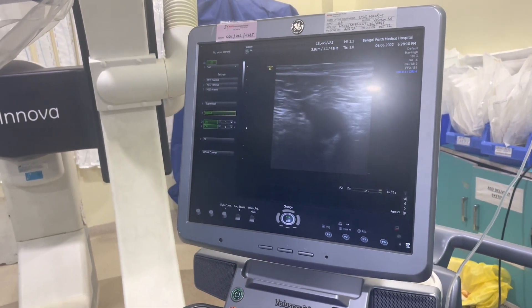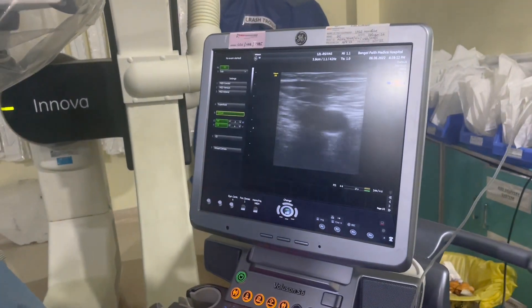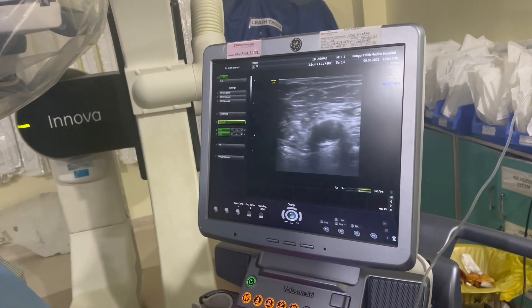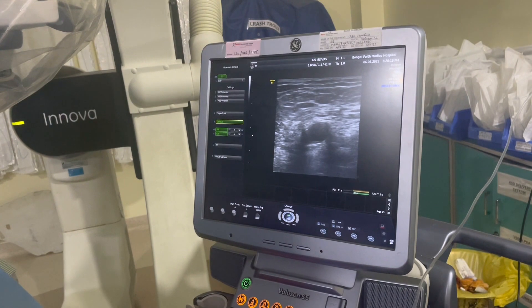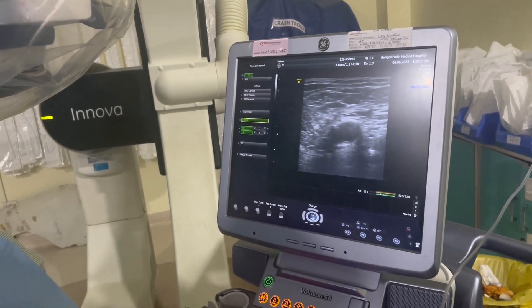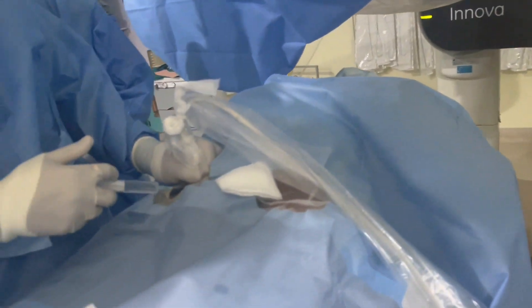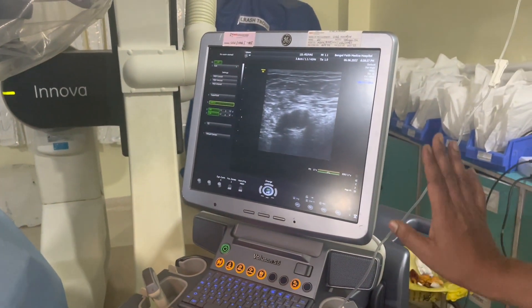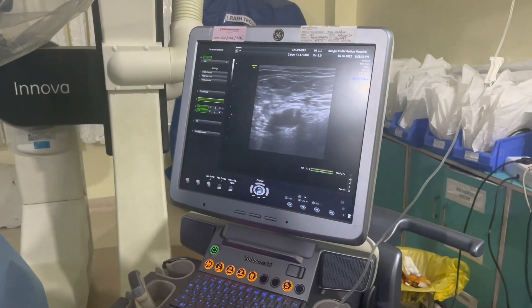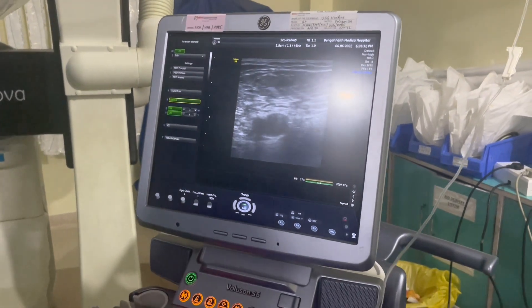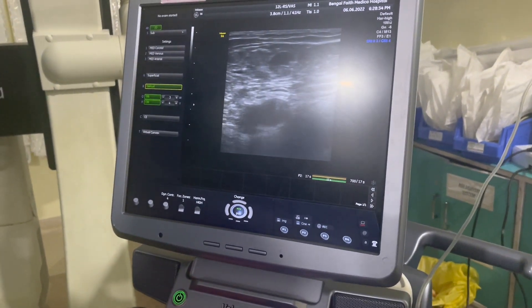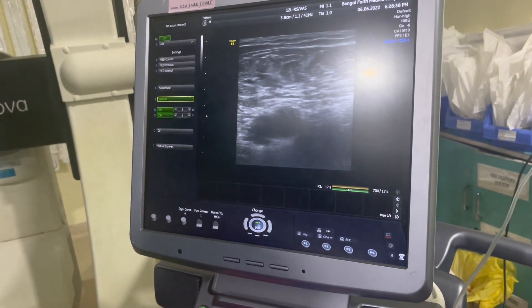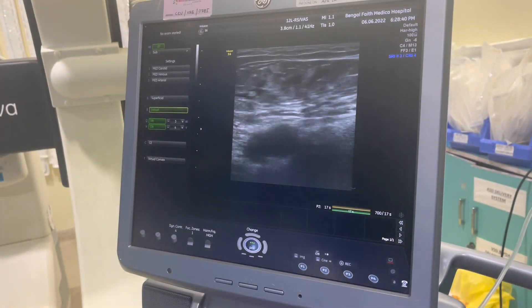Now we go off because we have to avoid the bifurcation. Now you see the femoral artery, which is well visible here and how it is pulsating. Now we will give a local injection. You can appreciate there — the tissue will split just above the artery, and we are giving this local injection.